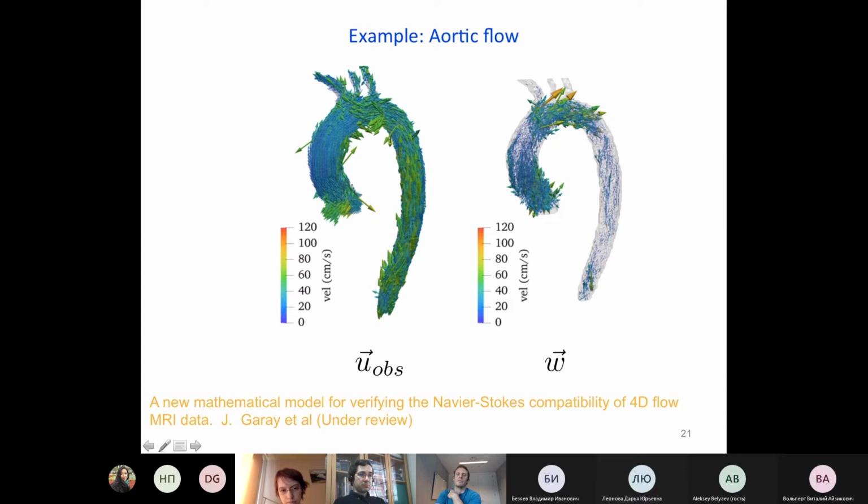So then, for example, if you want to compute flow rate, how much flow there is, you would rather cut here, where the value of the corrector is lower, and not here, because you expect to get worse results. And the nice thing is that this allows you to compare directly with the amplitude of the velocity. You can compute on the same scale because they are both comparable.